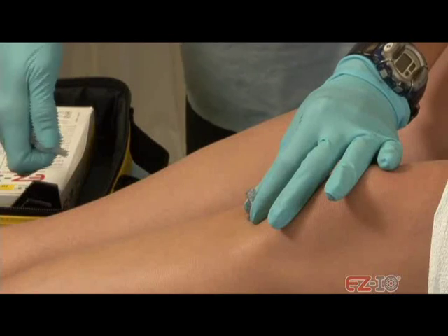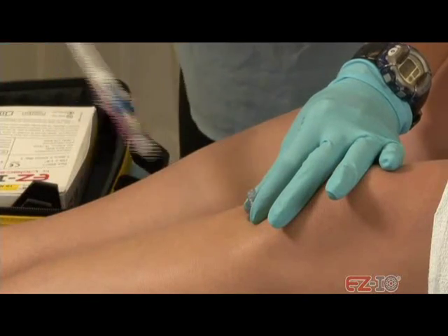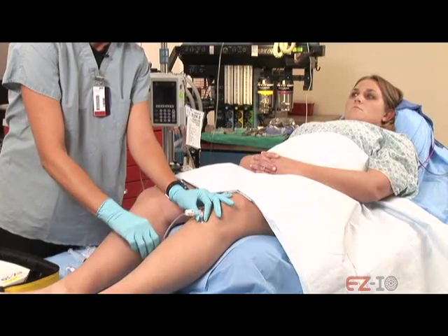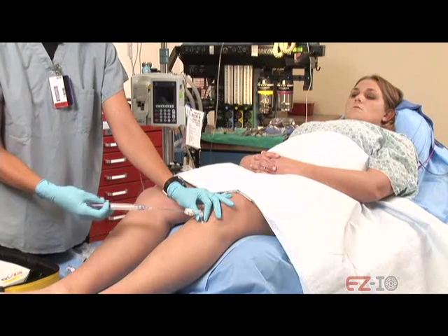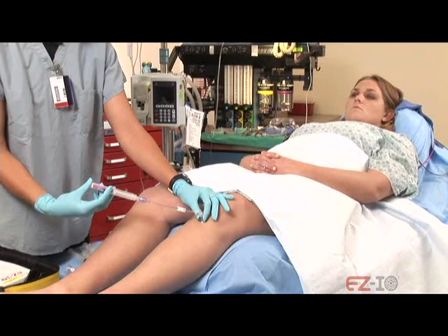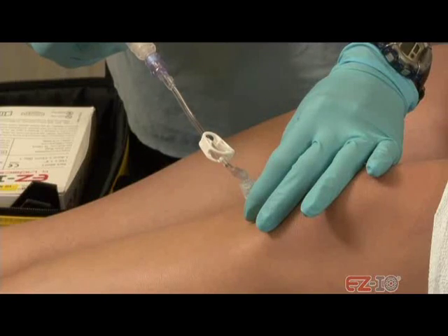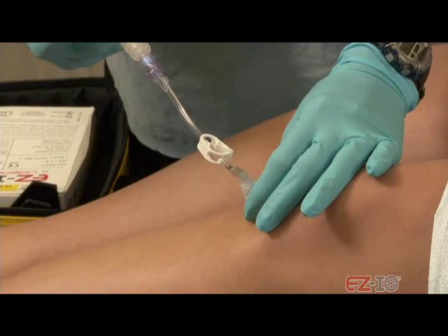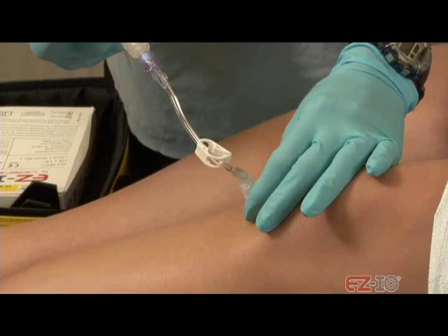This is the medication — it's going to make it numb, okay? So it's going to make it numb in there. As I'm putting it in, if I'm going too fast, if there's too much pain, let me know and I'll just slow down. Here we go — let me know if I'm going too fast. How are you doing? Fine. On a scale of 1 to 10, what's your pain? Like a 2.